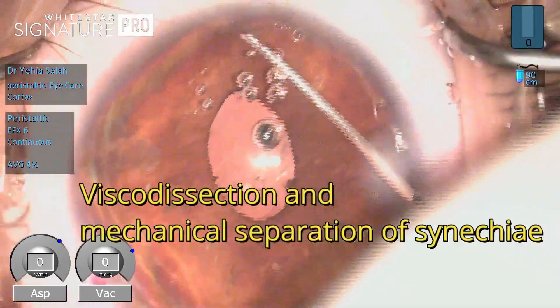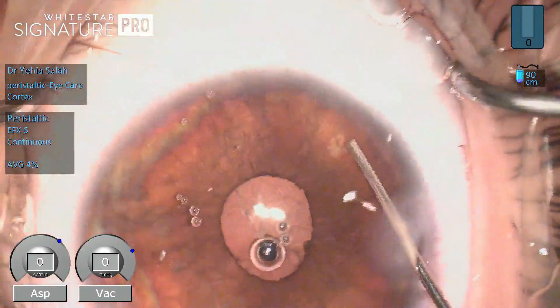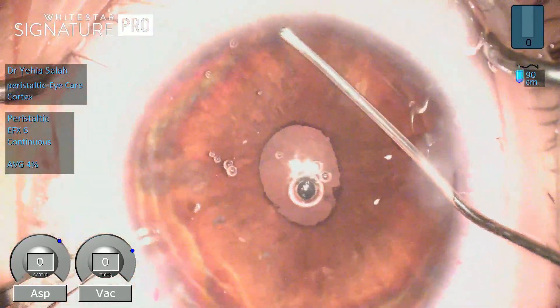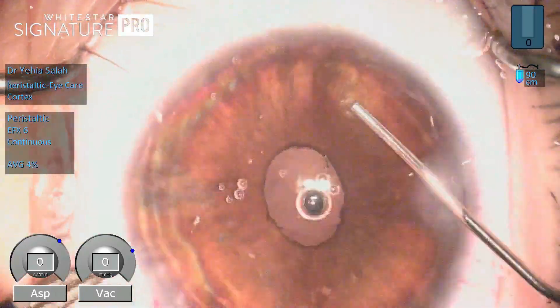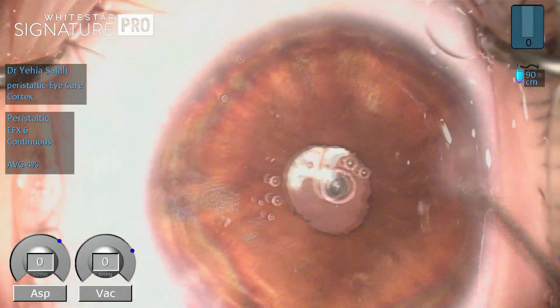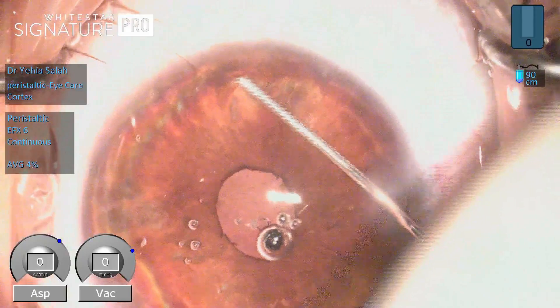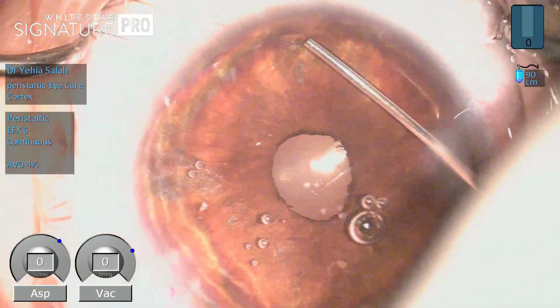I then paid attention to the angle of the anterior chamber. Using visco dissection with minimal mechanical dissection, I tried to free the peripheral anterior synechia. You should be very careful in this maneuver, as you might get severe hemorrhage. With cohesive viscoelastic you can dissect the synechia and open the angle of the anterior chamber.